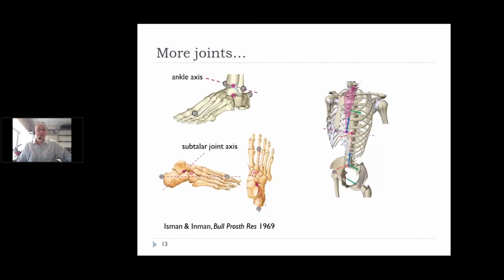And a few examples of that. For the ankle, we put the ankle joint center right in between the two markers, and the axis goes through the markers as well. And then we drop down a certain distance, and then we get the center of the subtalar joint, and in the subtalar joint we draw a line that's 42 degrees inclined from a line through these two markers.